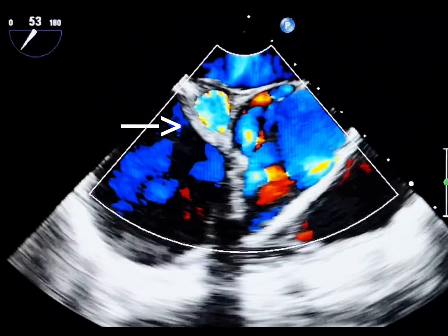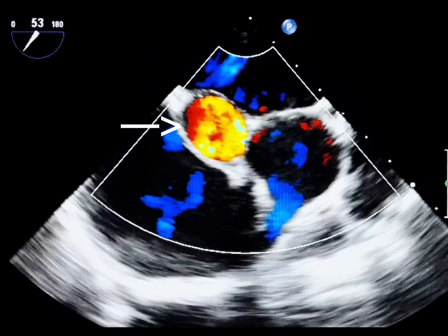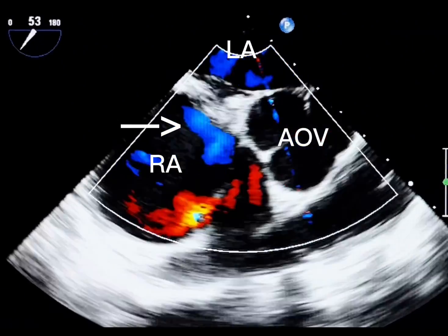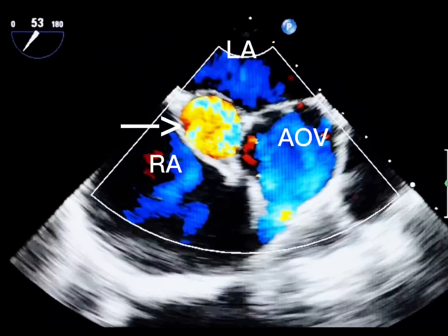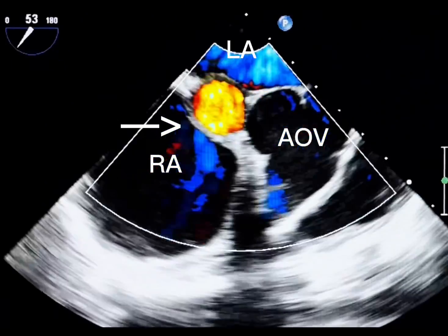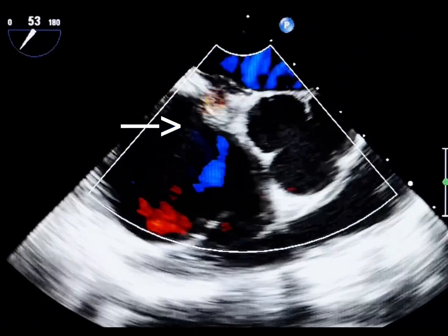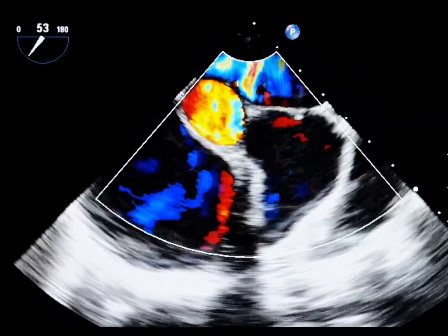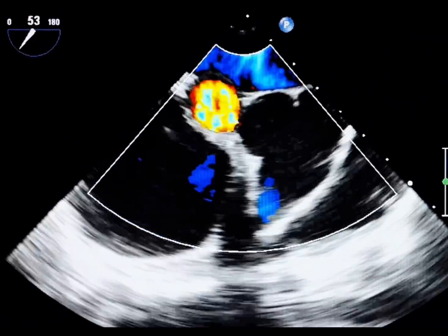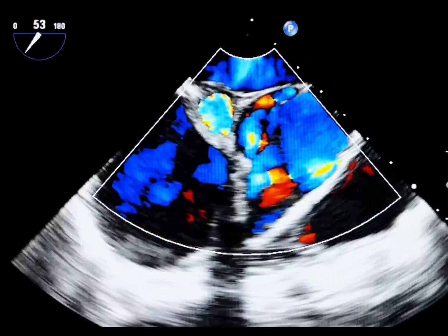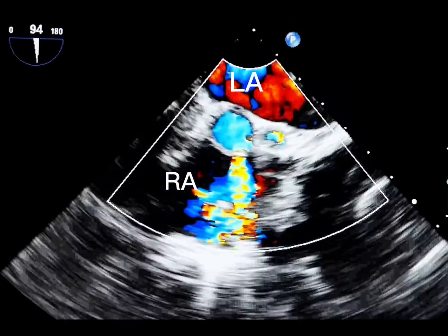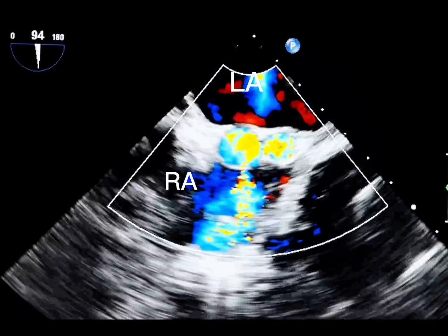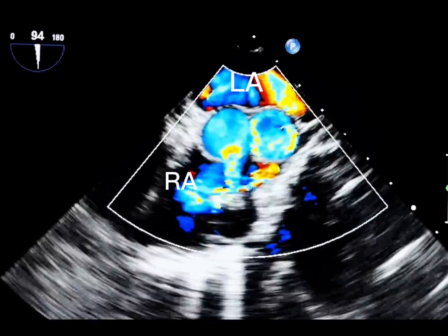A coronary artery fistula is an abnormal communication between a coronary artery and a cardiac chamber, great vessel, or other vascular structure, bypassing the myocardial capillary bed. Small coronary fistulas are often incidental and found accidentally.